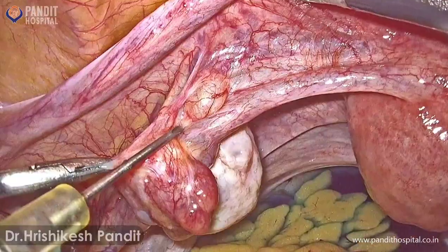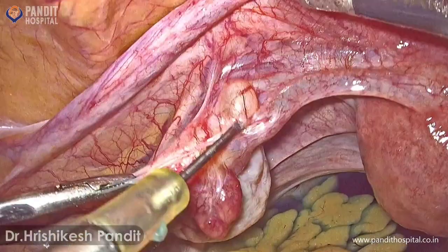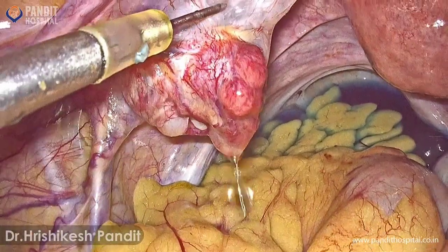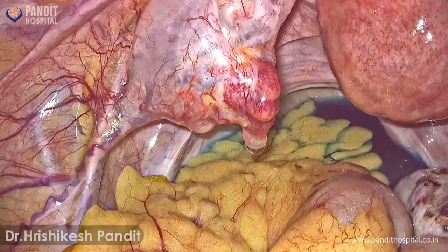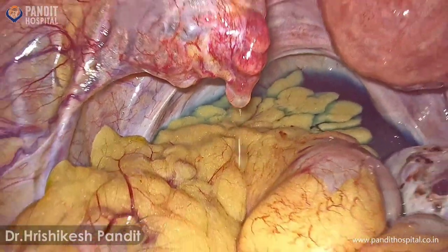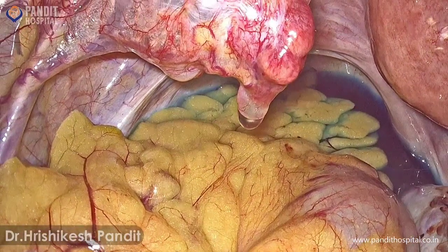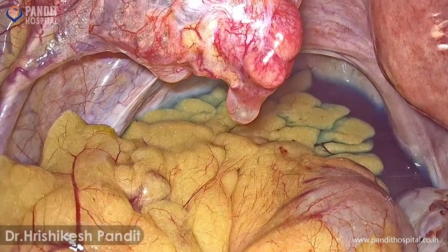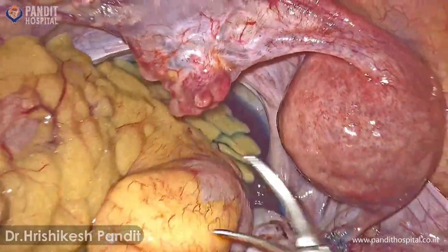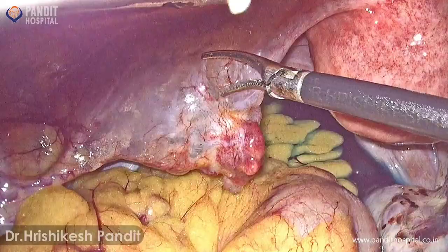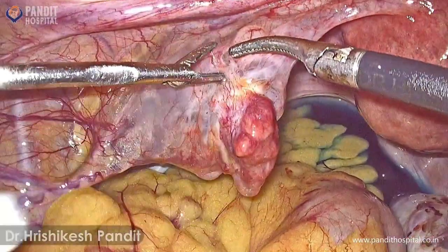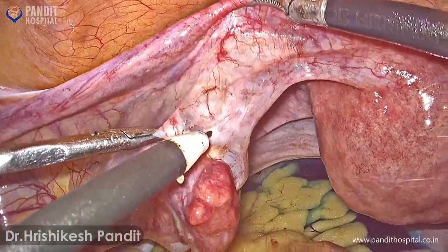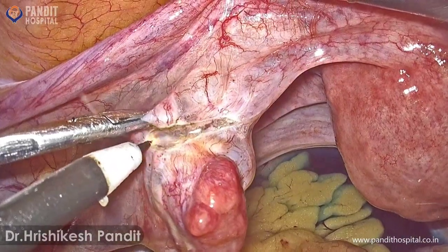The same situation is on the left side. First, we are going to inject vasopressin — you can use a Veress needle or a spinal needle from the center to inject it. While injecting, we have to inject close to the tube so that when we cut the tube it should not bleed.